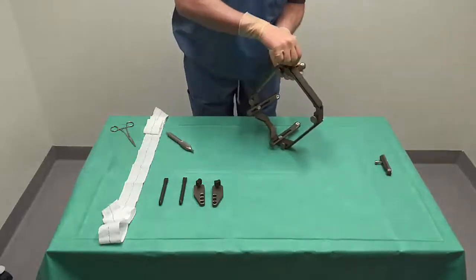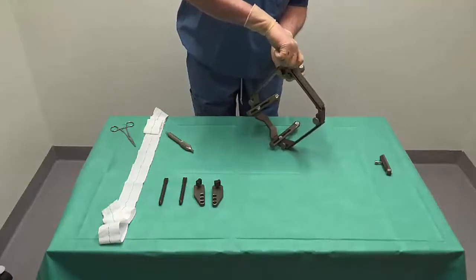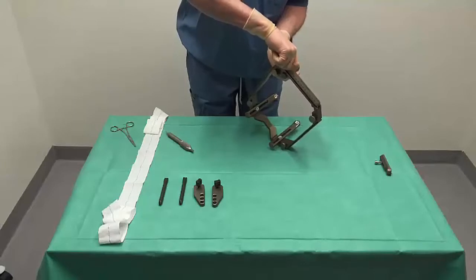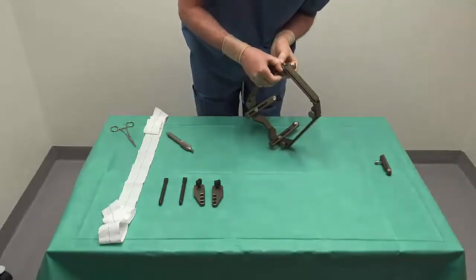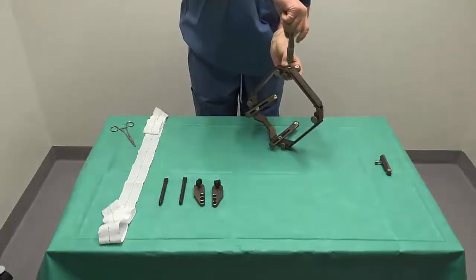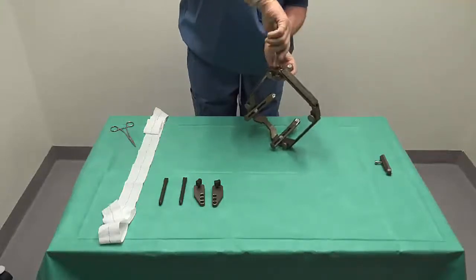We continue by applying the short posterior fixation posts. These are placed such that the inferior end of the post protrudes 1 cm below the lower edge of the frame. Very rarely, it will be necessary to change the position of the fixation posts, but this is decided later when the frame is on the head of the patient.